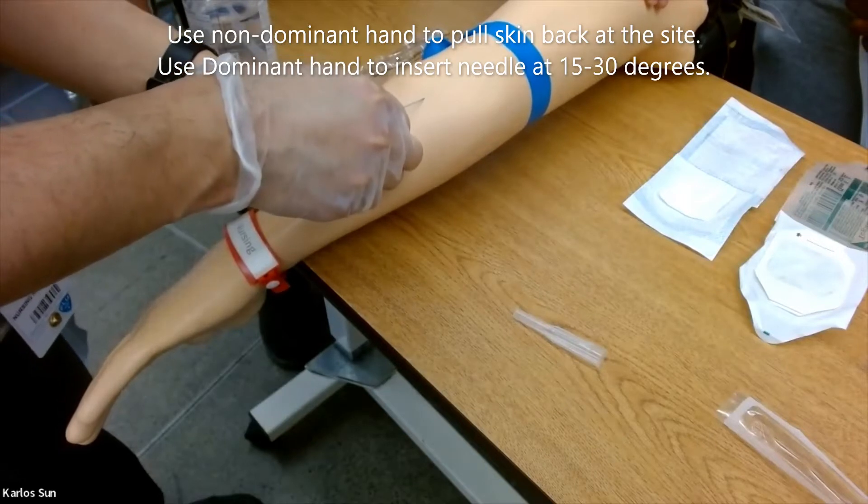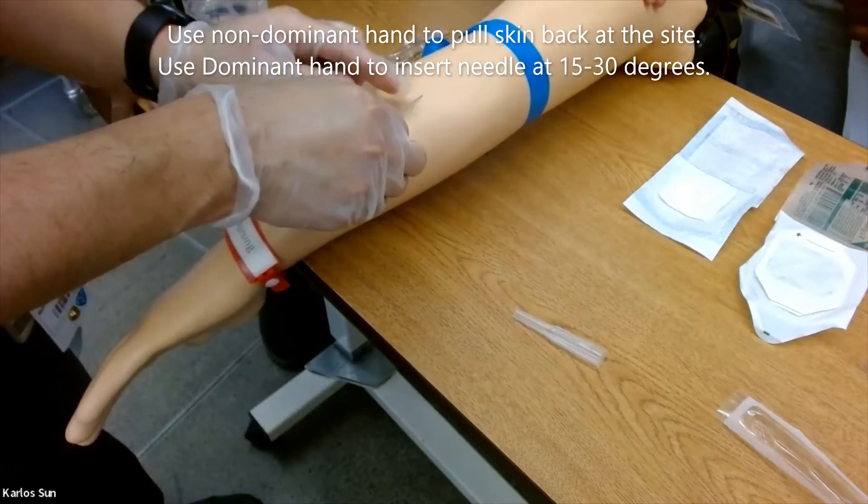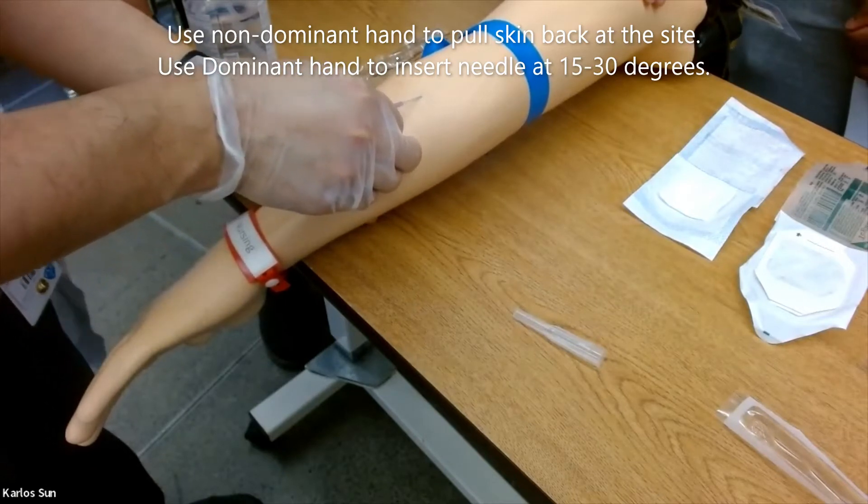Use your non-dominant hand to pull the skin back at the site, then use your dominant hand to insert the needle at 15 to 30 degrees.